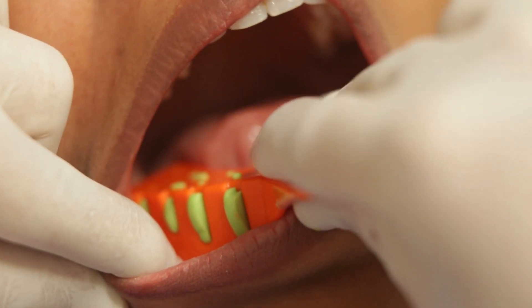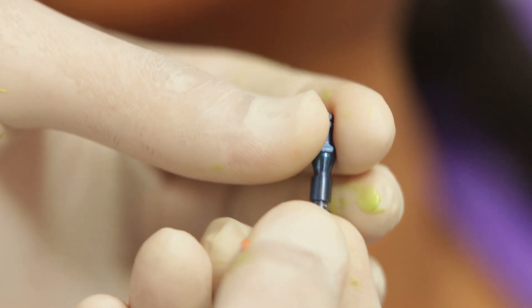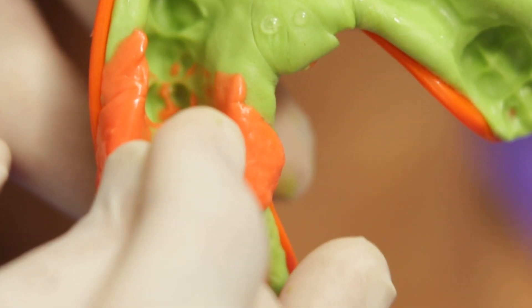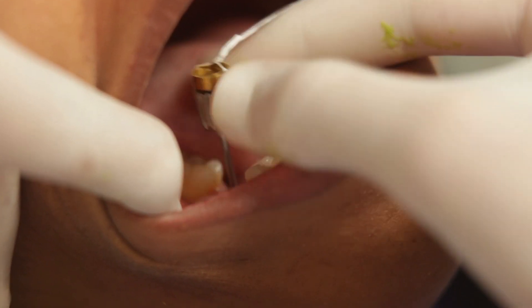Once the impression is done, the impression cap is picked up along with the impression. I will now remove the impression coping from the implant, attach the lab analogue to it, and seat it back into the impression onto the impression cap — the rest will be done in the laboratory. And don't forget to put the healing abutment back onto the implant.